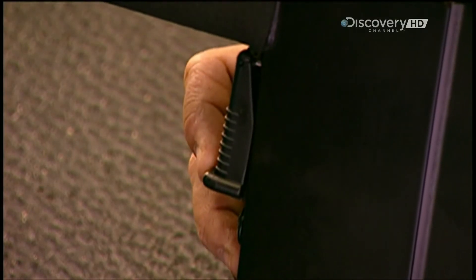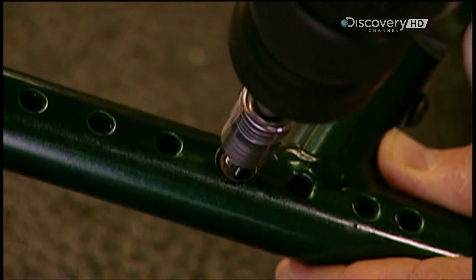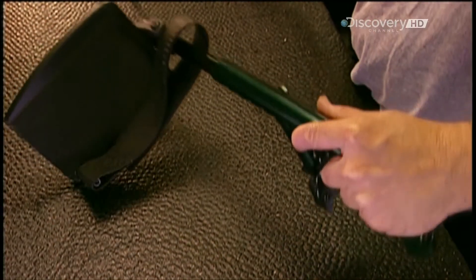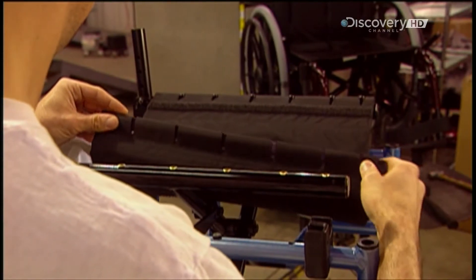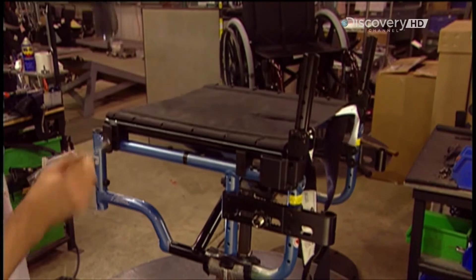Workers test the height adjustment lever for the armrest. Then they install a removable aluminium footrest, setting it to the desired length. It has a heel loop to prevent the user's foot from slipping off. The chair has a foldable sling seat made of nylon, which attaches to the frame with six screws on both sides.